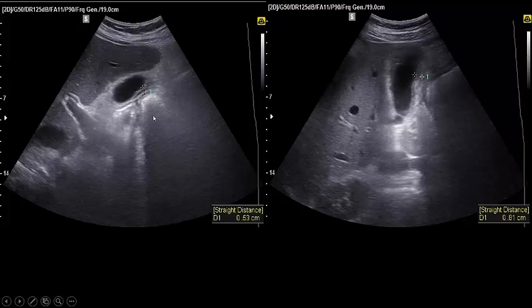And really in this patient, when I press with my probe here on the gallbladder, there was severe pain, which is the sonographic Murphy sign. Sonographic Murphy sign with edematous thickened wall and no stone seen. This is going with acalculous cholecystitis in this patient, and this is very important, with this hyperechoic area all around, denoting inflammation, because this is edematous mesentery.